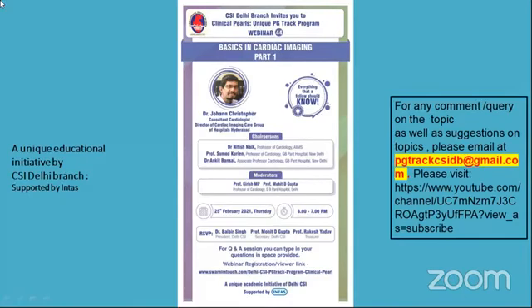So if I have a patient with elevated T1 and an elevated ECV on the septum, clearly this is pathological hypertrophy of the septum. It's not an athlete's heart. It's not hypertensive heart disease, but it is clearly a cardiomyopathy of some sort, most probably a hypertrophic cardiomyopathy, could also be Fabry's disease.